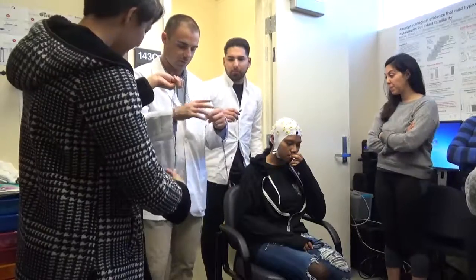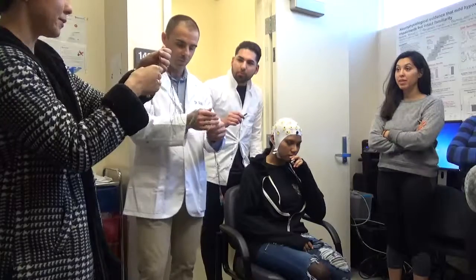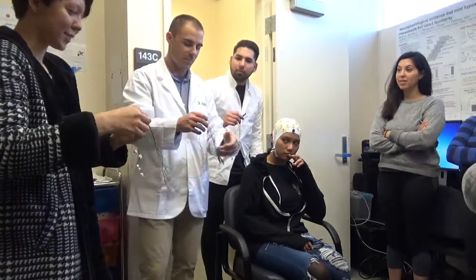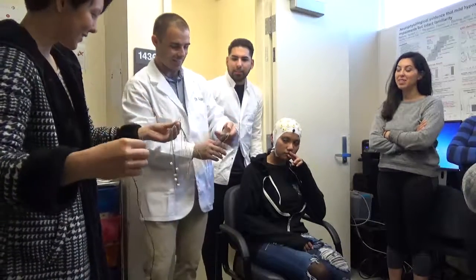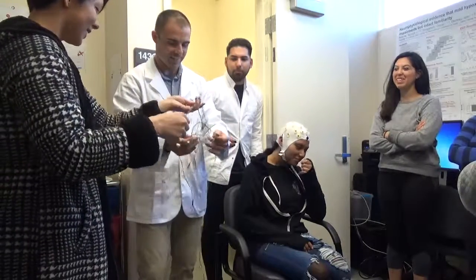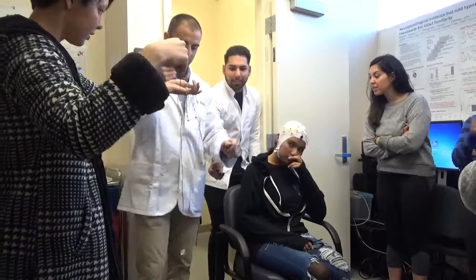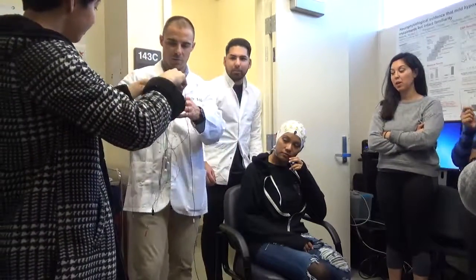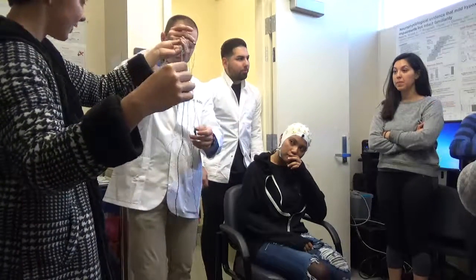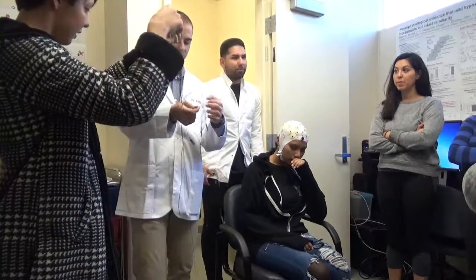Okay, so get these tangled up. Yep. It's really important to do this part before you get to the point where you apply it, because this can take me up to 15 minutes to untangle. Fun. Yeah, that's fun. You thought headphones were bad. Okay, so trying to get the ground out of here. You guys ever thought of using binder clips? What's that? Using the binder clips for what? To not have them get tangled up. That is a good idea. Maybe we will start doing that.